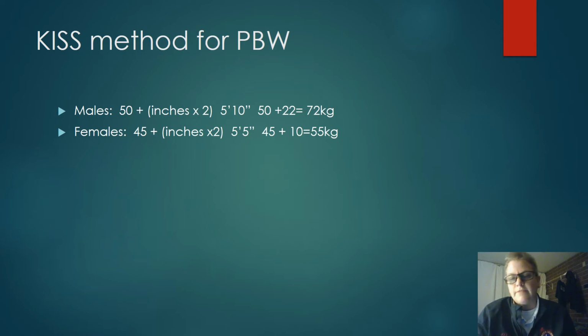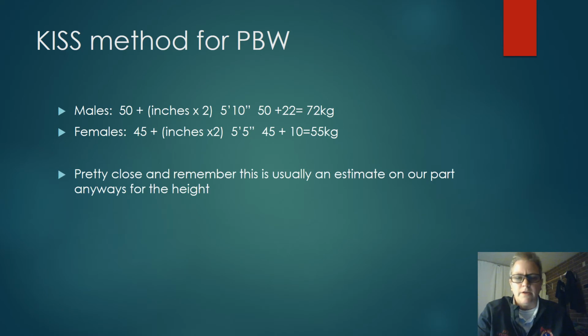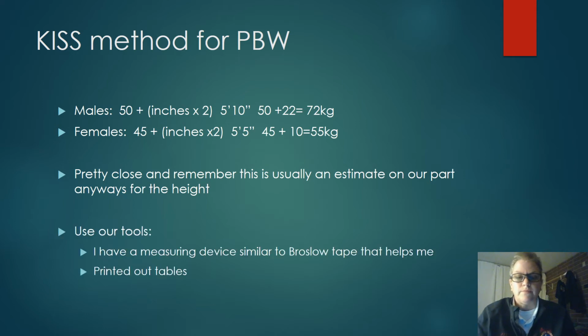Okay, I like the keep it simple, stupid method. It's pretty much kind of a guess on how tall they are. It's great if they know exactly, but is that a true 5 foot 5.5 inches, 5 foot 5 3/4? You know what I'm saying? So just estimate on that and take off those decimals.